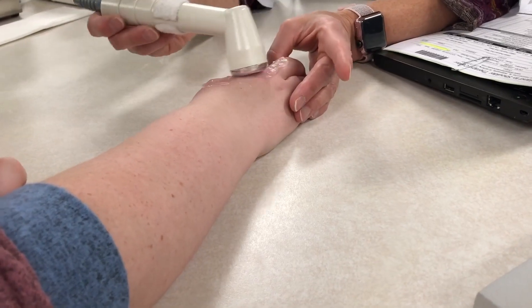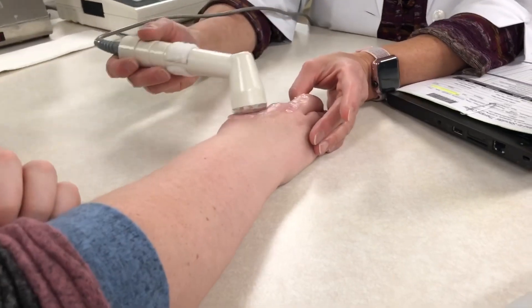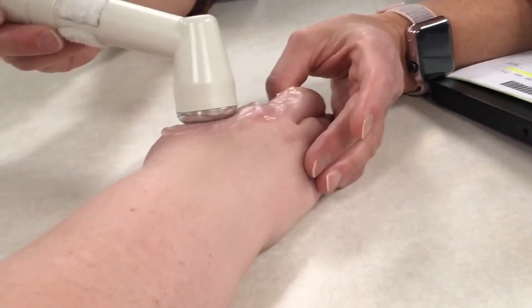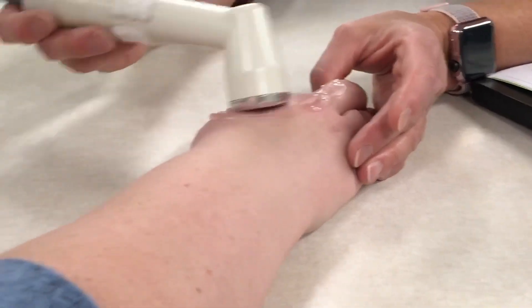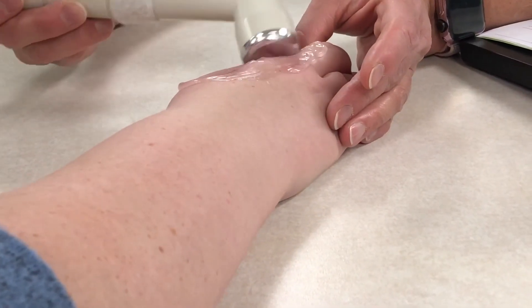Here is a clip showing what they do to my hand during ultrasound therapy. This is sped up, of course. They slowly massage along my scar and the wand that they're using heats up, which helps to break down the scar tissue.